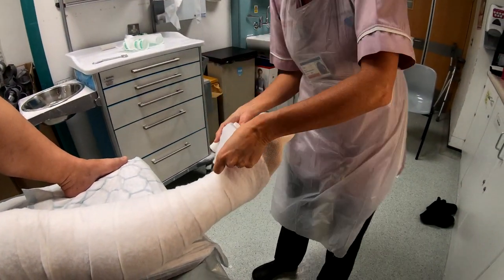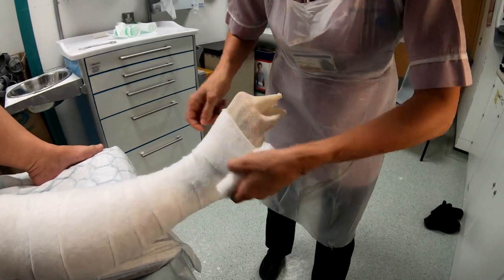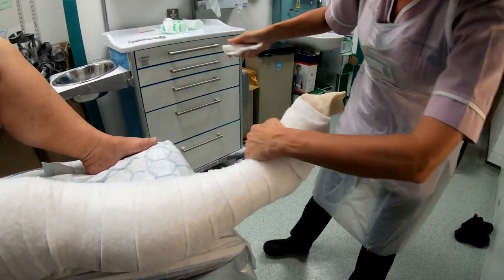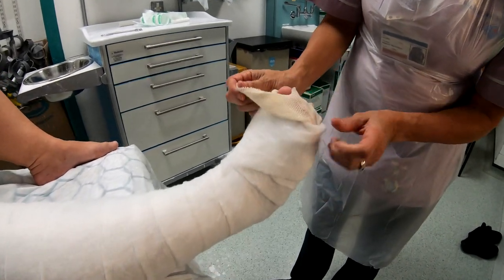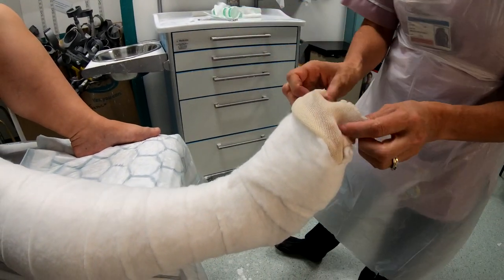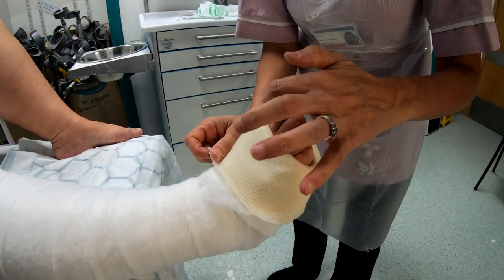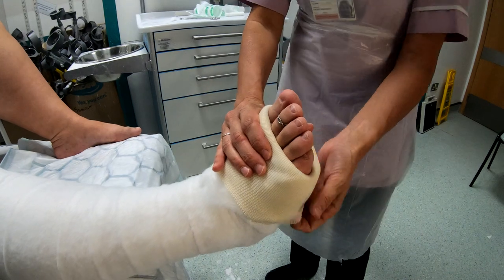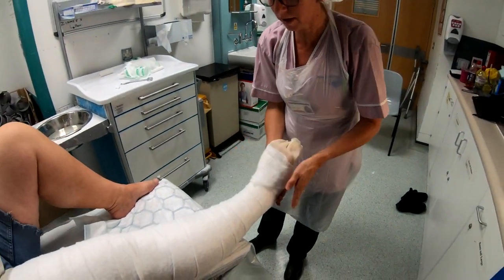We've got a little bit spare here — make sure it's all covered. And we still bring this really high up to the toes, like we did in the below-knee backslab. You can then check your positioning; make sure all the toes are exposed. We're still going to take a little corner off like we did before, just to ensure that the little toe doesn't get hidden. Obviously, if there was a ring on a toe, we would ensure that jewelry was removed.